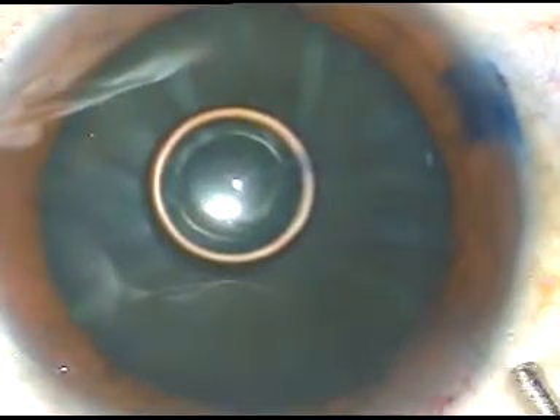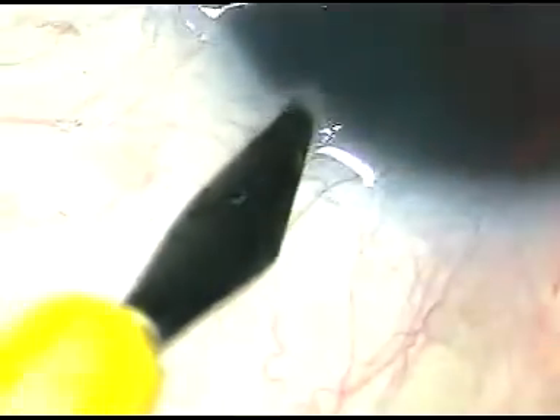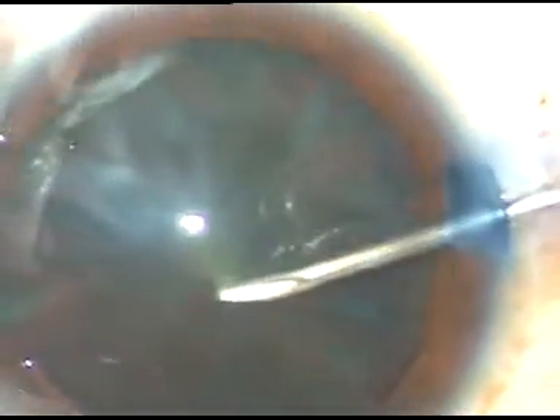This is HPMC. One more side port is to be made for introduction of the chopper and use of bimanual irrigation aspiration. The incisions are made, and now capsulorhexis is to be done. Incising the anterior capsule with this bent needle, 26-gauge needle.